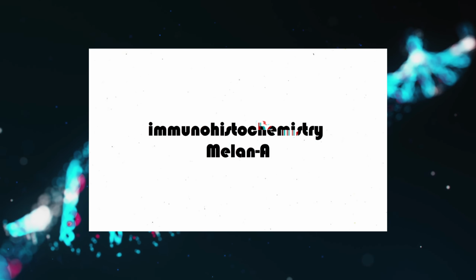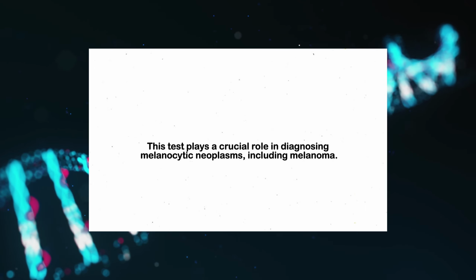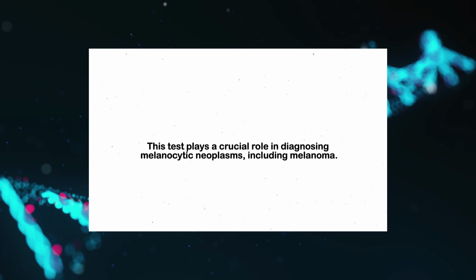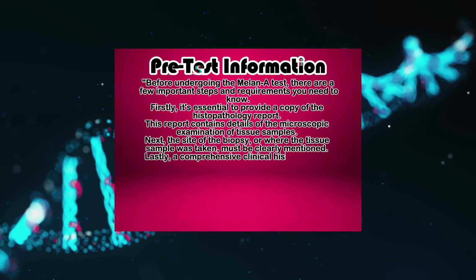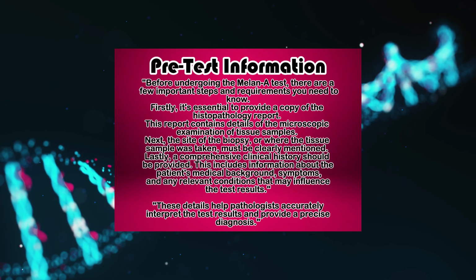We're diving into the Melan-A test in immunohistochemistry. This test plays a crucial role in diagnosing melanocytic neoplasms, including melanoma. Let's explore everything you need to know. Pre-test information. Before undergoing the Melan-A test, there are a few important steps and requirements you need to know.